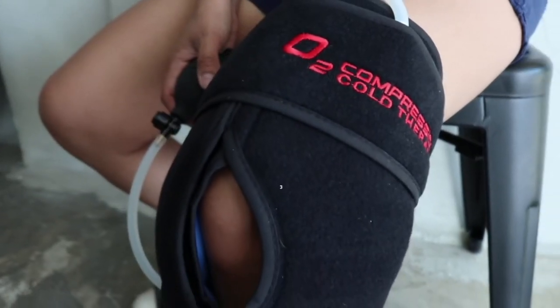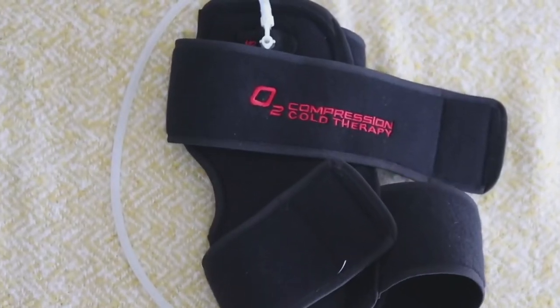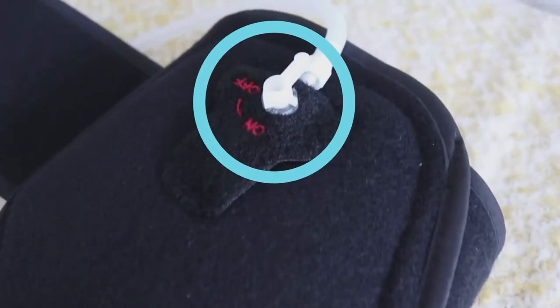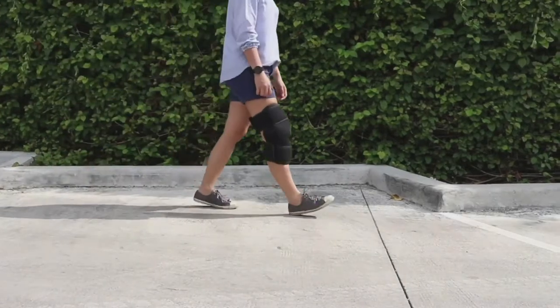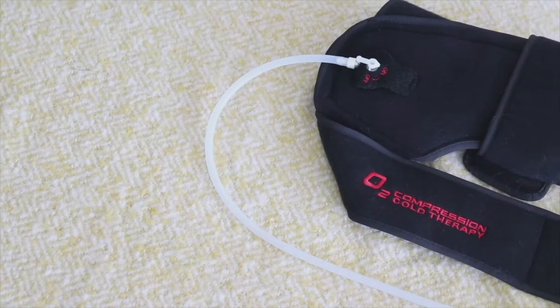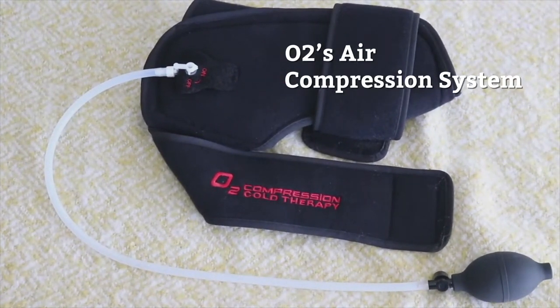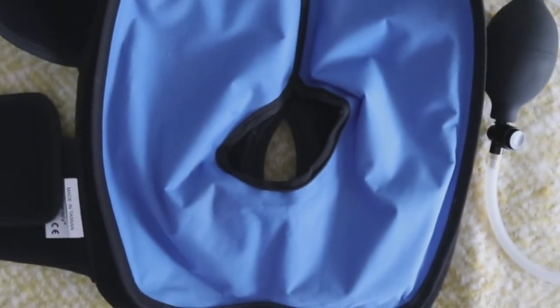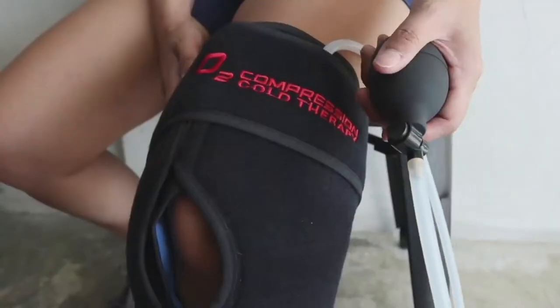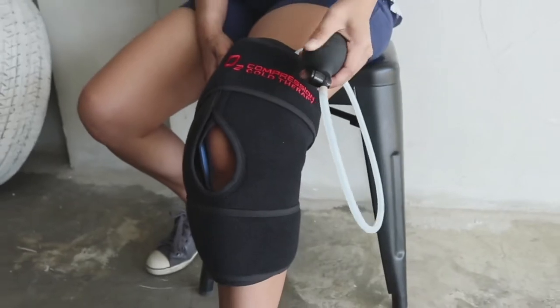Coming in at third place is the O2 compression cold therapy knee wrap. O2 is perhaps the bulkiest knee wrap on this list because of this curious little valve. Thankfully, it performed really well, so it's still a worthy runner-up. The tubing is part of O2's air compression system. Aside from the gel pack, O2 has an additional air bladder inside, which contributes a lot to the bulk factor. While it may look a bit intimidating to first-time users, it's actually pretty easy to use.